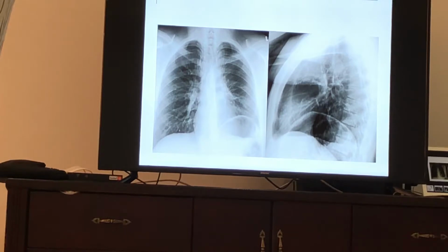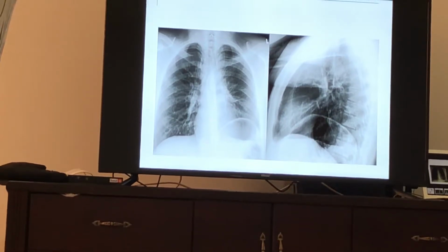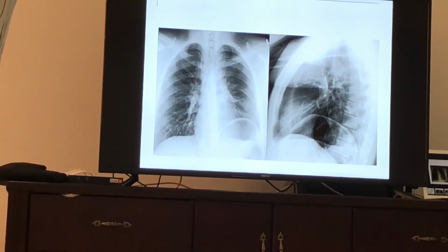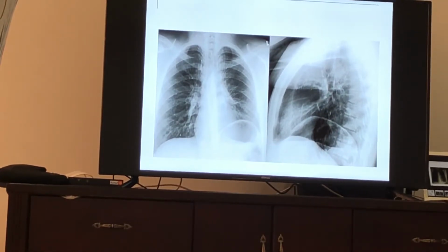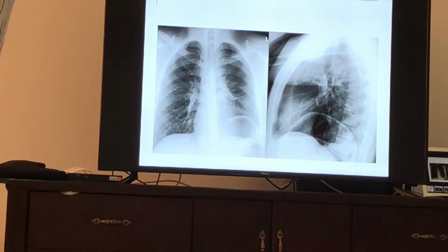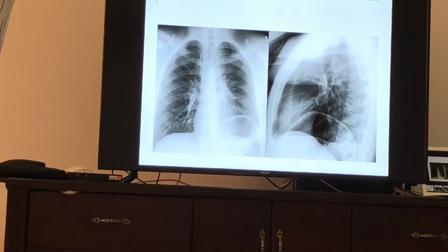There is no absolute in medicine. Normally the air under the diaphragm won't be so high. It could be or could not. Maybe he already has paralysis for some reason. Then he got pneumoperitoneum. And this same patient, unfortunately, later got something. We don't know. But are they related to each other? Will it cause it? No, it should not cause it. Any air on the diaphragm in a normal functioning diaphragm should not elevate the diaphragm like this. That's the question. So no, it should not.